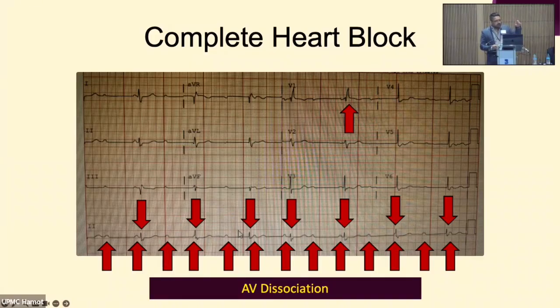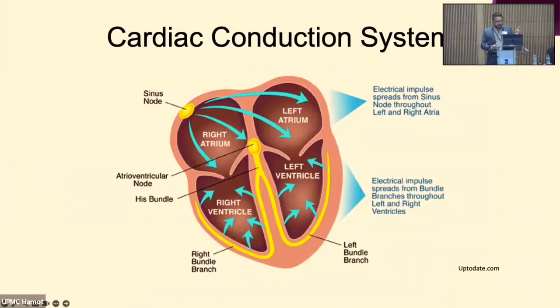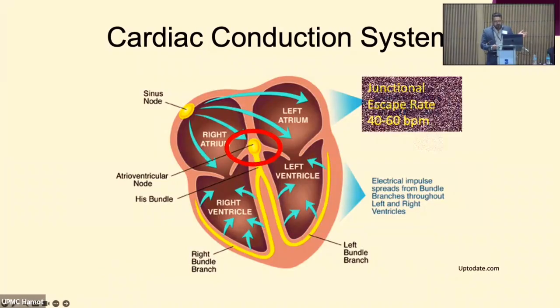The region of the AV node, the subsidiary pacemaker, is working, as opposed to the previous patient I showed you when they just go into complete heart block. They have no escape, and that's very troublesome because then they both need a pacer, but that patient needs a pacer much more urgently.